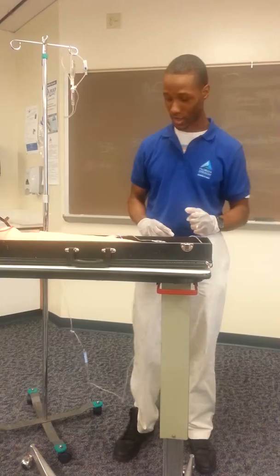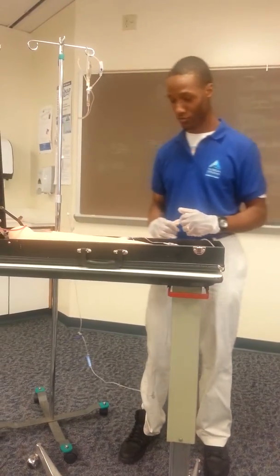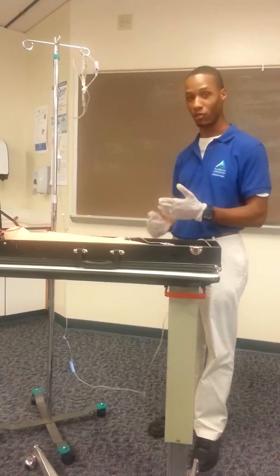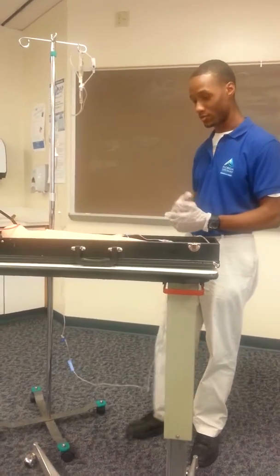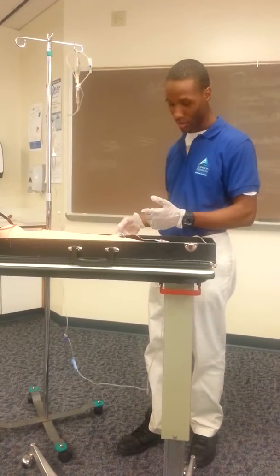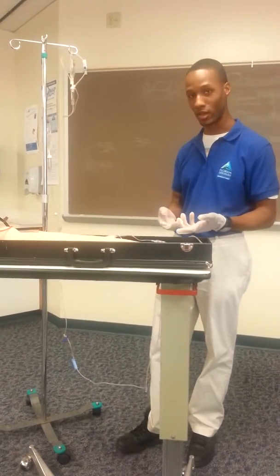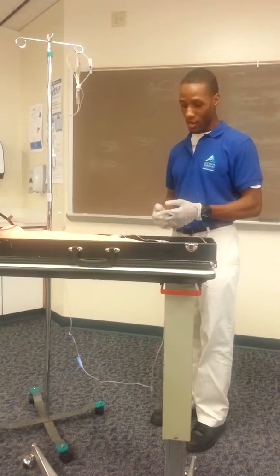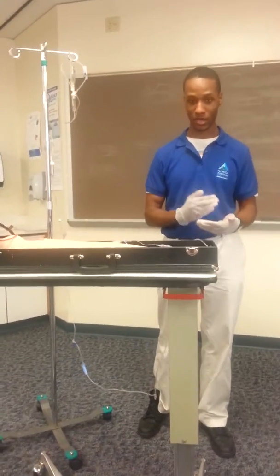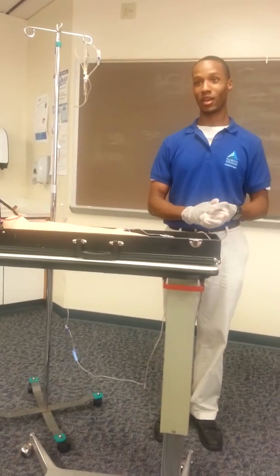And again, assess the site for bruising, swelling, discomfort. And this patient has stated none. Assess for the 4 Ps, pain, any pain, level 1 to 10, using the restroom, unit comfort position, and possessions. I would give the call light again. And I would document the amount of fluid, condition of the site, how the patient handled the procedure.